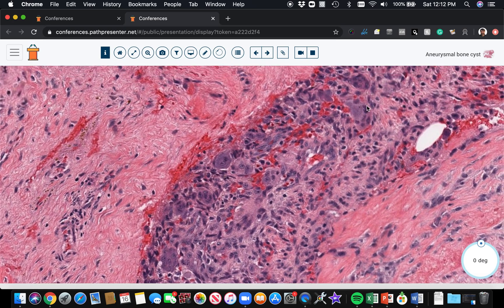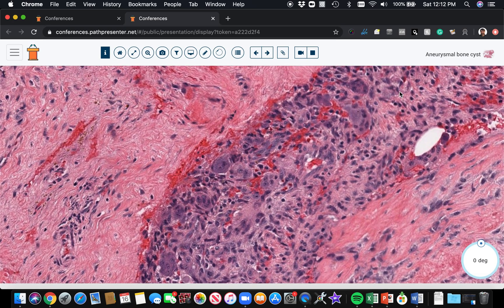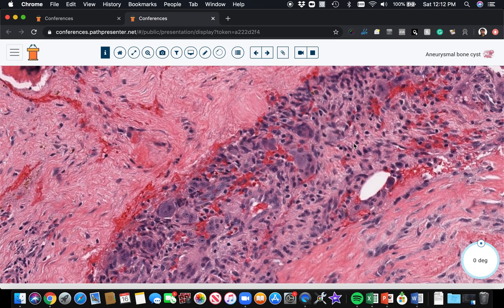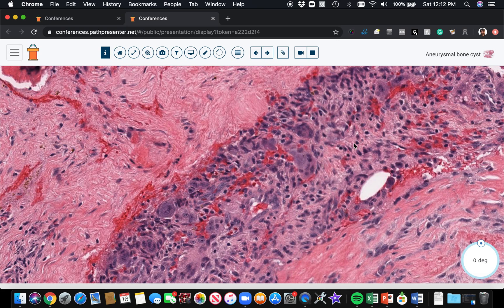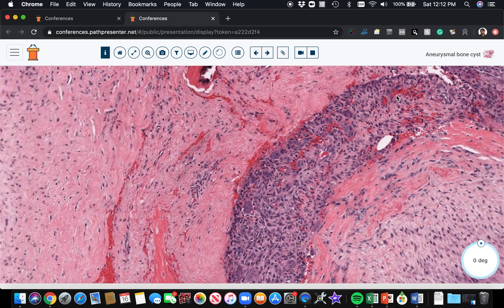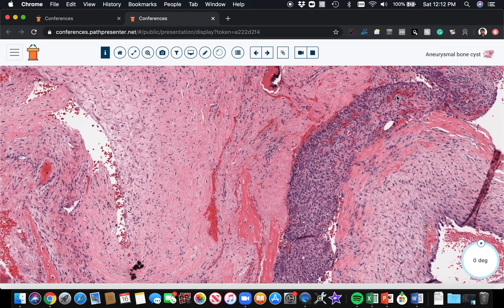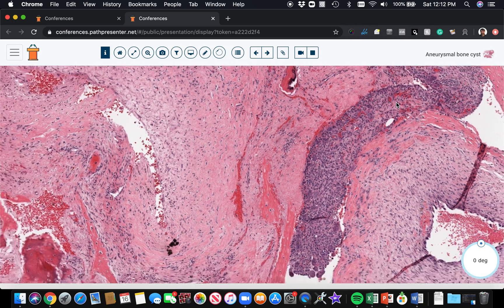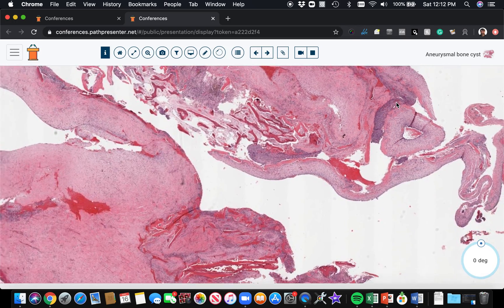And you don't want to confuse that with giant cell tumor of bone. There's another area right here - see, there's like a collection of giant cells. And if you take one little area like this it can look quite a bit like what you see in giant cell tumor bone.